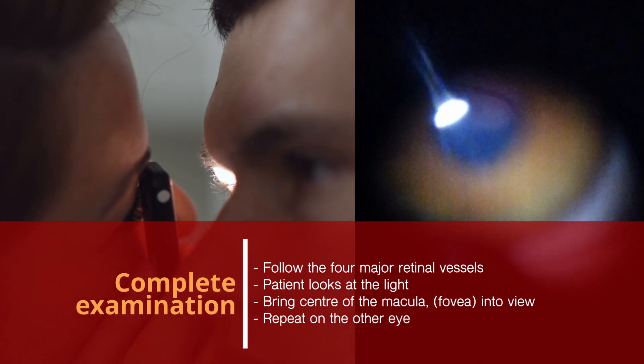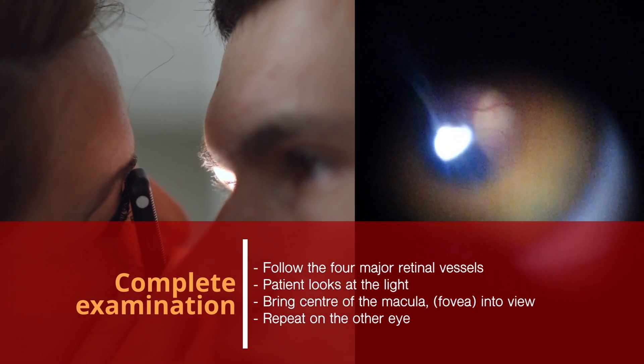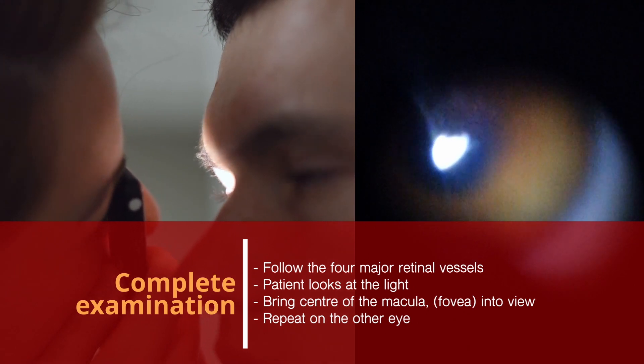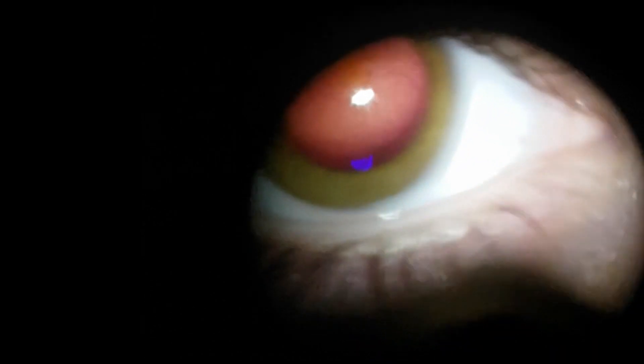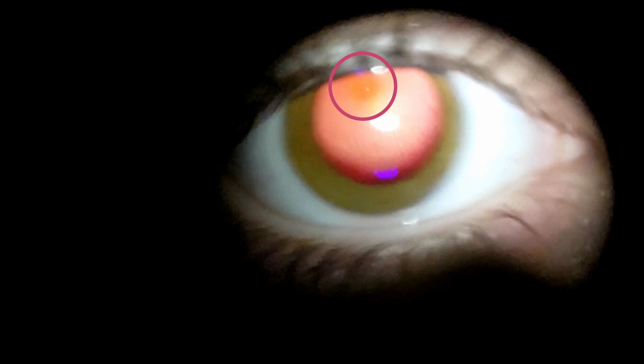Finish by asking the patient to look into the light to bring the centre of the macula, called the fovea, into view. In a non-dilated eye, this will cause the pupil to constrict and you will lose the view. In a dilated pupil, the fovea can be seen as a slightly darker zone with a pinpoint reflection.